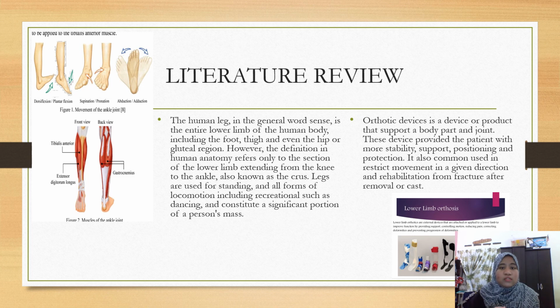An orthotic device is a device or product that supports a body part or joint. This device provides the patient with more stability, support, positioning, and protection. It is also commonly used to restrict movement in a given direction and for rehabilitation from fracture after removal of a cast. So, this is a picture of orthotic devices in the market.